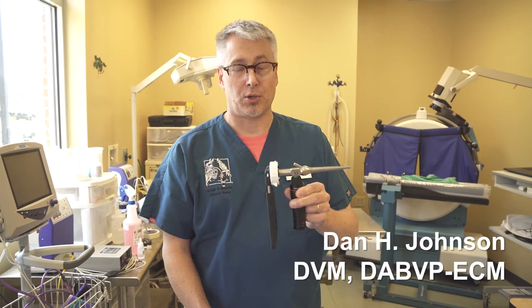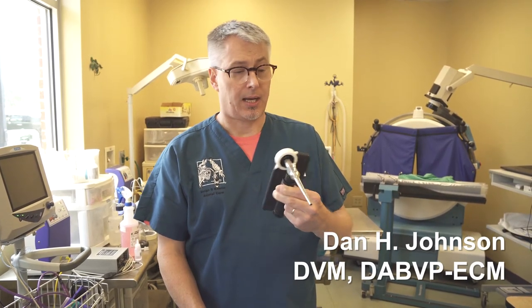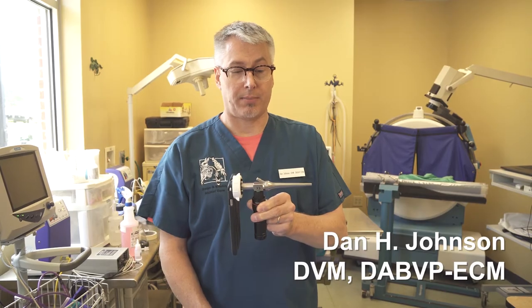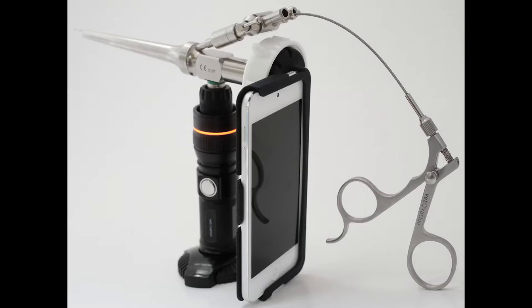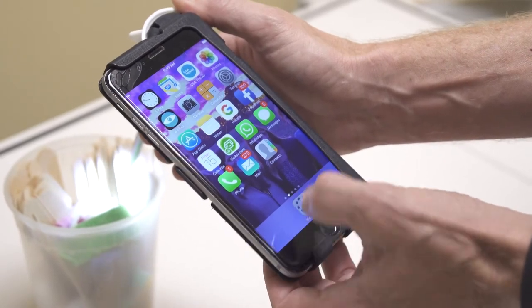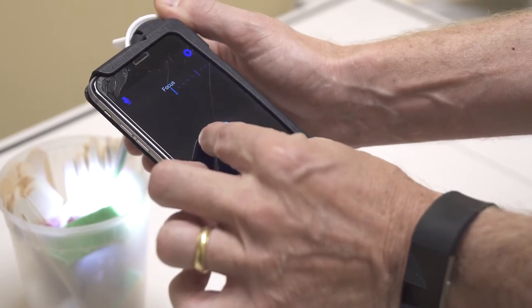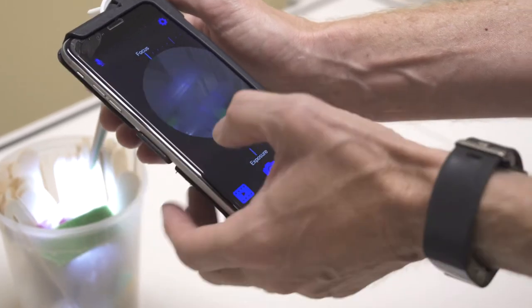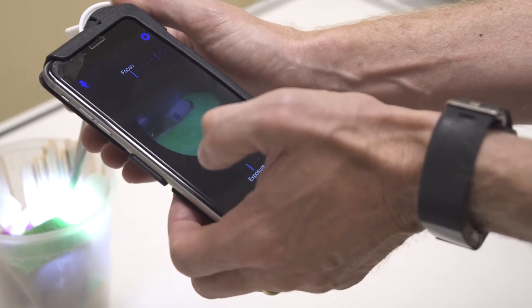I like Vetovation's video otoscope for intubation of rabbits or any small exotic mammal where this will fit. Once you've downloaded the Vetovation video otoscope app, you'll be able to go into the app, easily adjust the size of the field of the image, and focus by tapping the screen to bring it into clear focus.